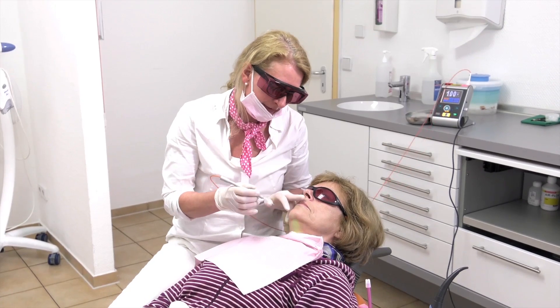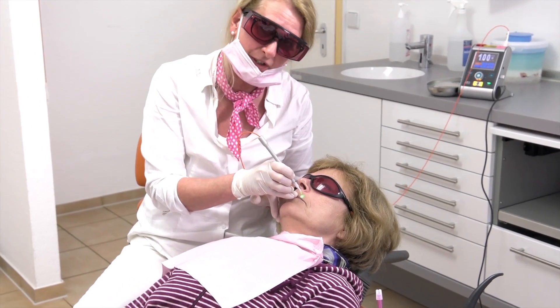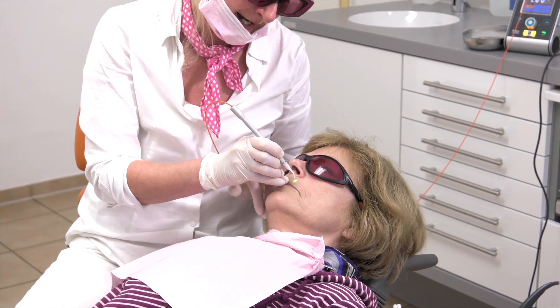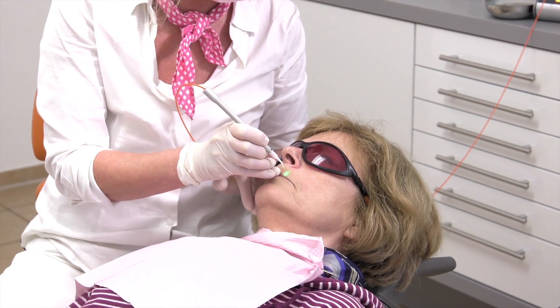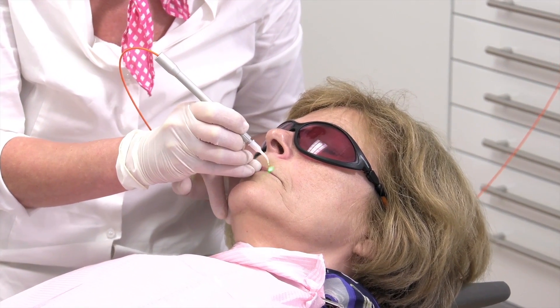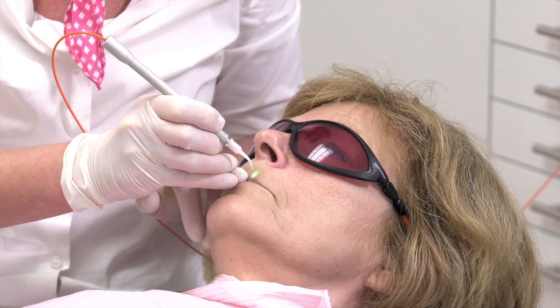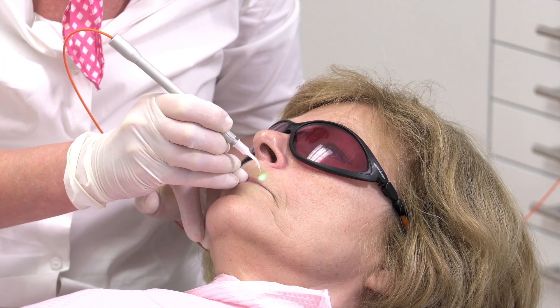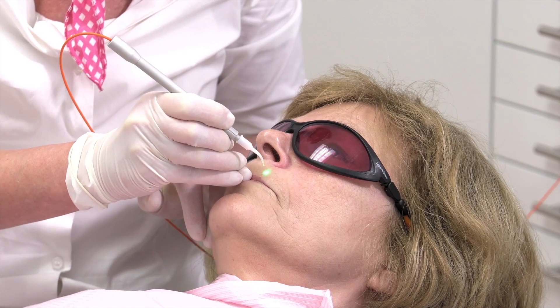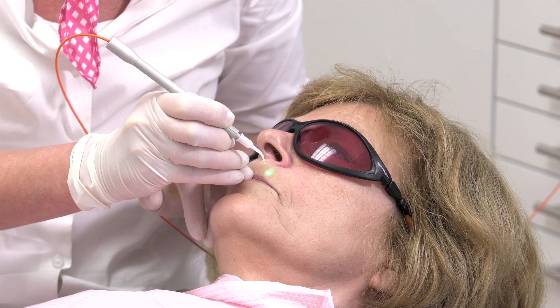It's very important that the fiber has a distance of one centimeter to the skin surface. And the second important thing is that you already start moving the fiber before the laser is active. Each treatment pass needs 30 seconds for one centimeter.